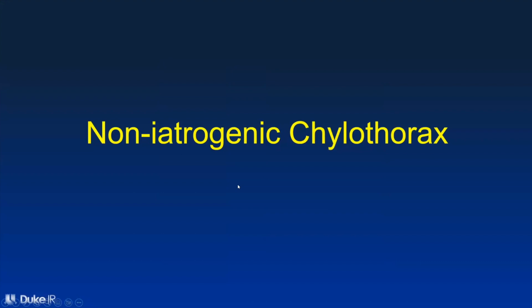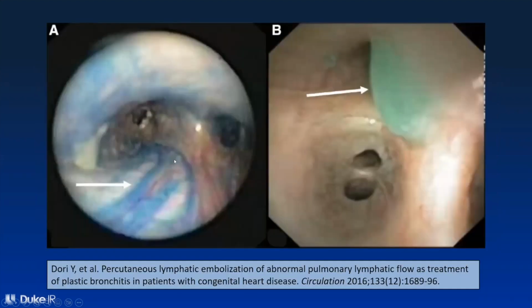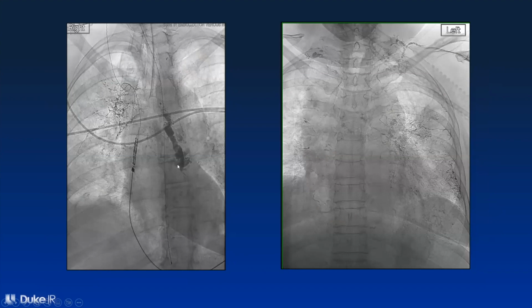Some patients have non-iatrogenic chylothoraces, so leaks in the chest that are not secondary to surgery or procedures. And that's the case for patients who have plastic bronchitis. Patients with plastic bronchitis have shortness of breath, and they cough up these white casts. And you can see in this case, they infused methylene blue into the lymphatic system, and you can see the methylene blue when the pulmonologist is doing the bronchoscopy. This is how the casts look upon bronchoscopy, and this is how the lymphangiograms look on those patients.